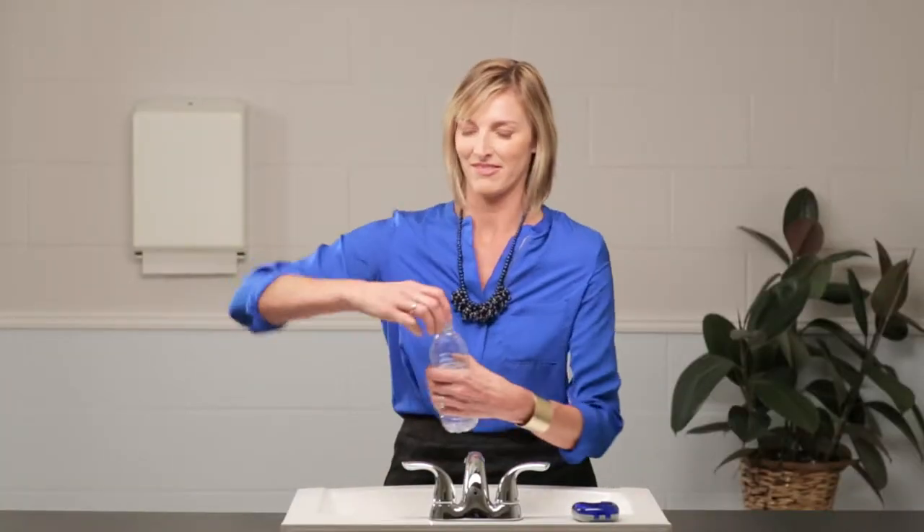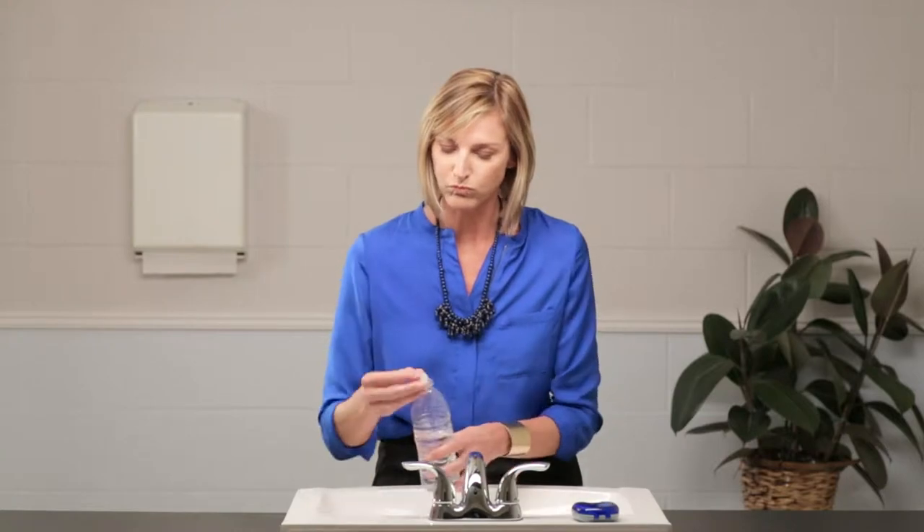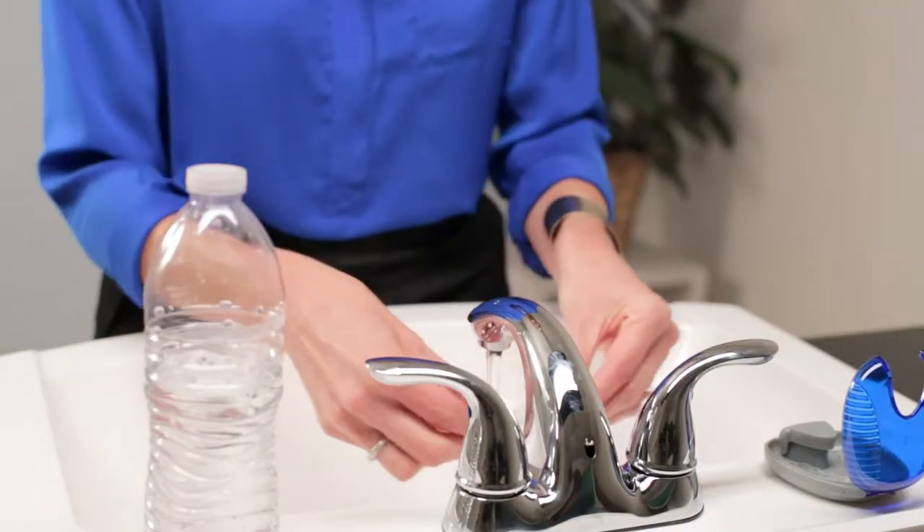Ideally, you should brush and floss after every meal or snack, but if you don't have a toothbrush with you, rinse your mouth and clean your aligners by holding them under warm running water.